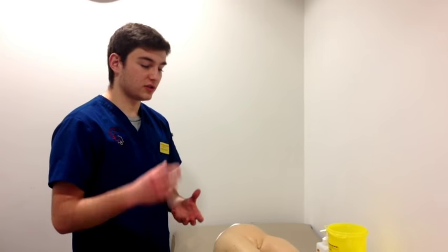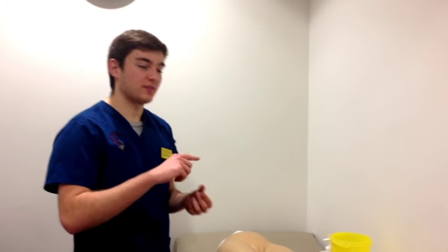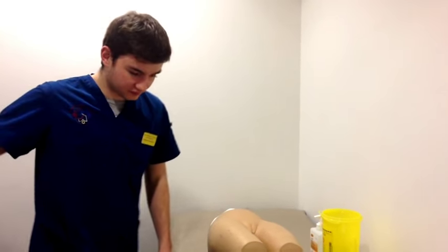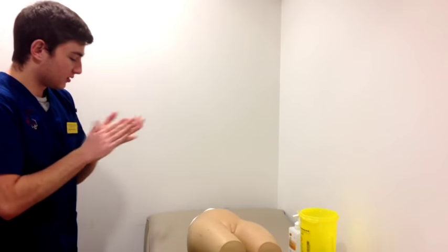Alright, now we're going to start our injections. Because I did the dosage in the vial at the bedside, I will not be using the tape. Otherwise, if you're doing this away from the patient, you should be wrapping tape around it and writing the medication and the dose onto the syringe itself. So now, since I'm by the bedside, I'm going to be drawing the curtain around, use some hand hygiene, and I'll inform the patient about the procedure that I'm about to give.